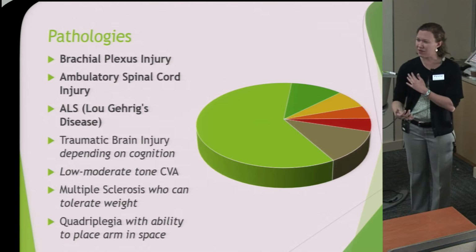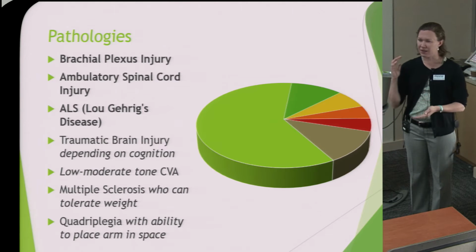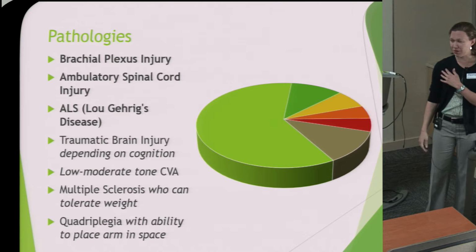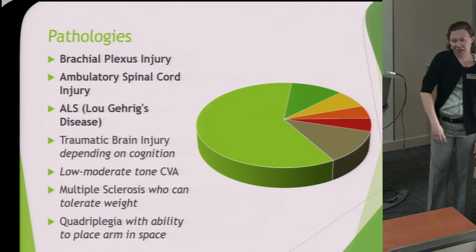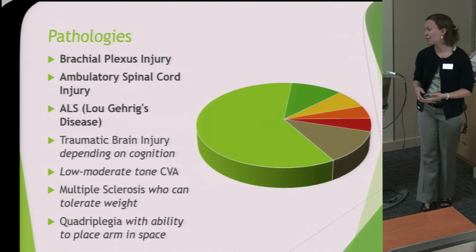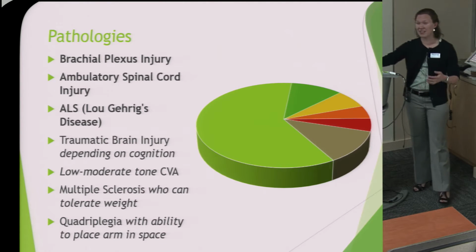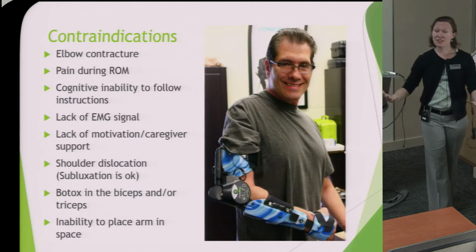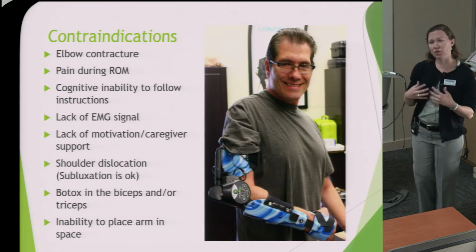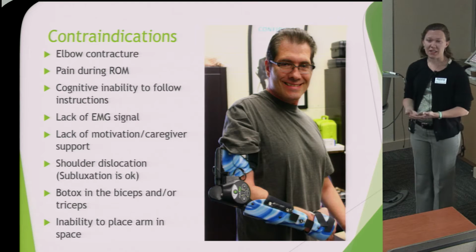If they don't have any shoulder flexion, then even if I give them the ability to fully flex their elbow, they're not going to be able to reach their mouth for feeding tasks, hygiene, things of that nature. So even if it's not pretty, as long as they can get that arm from one place to another, that's really what we're talking about with those patients. As I said, not an all-inclusive list. There are multiple other pathologies out there. So really what we're looking at is the patient presentation itself.